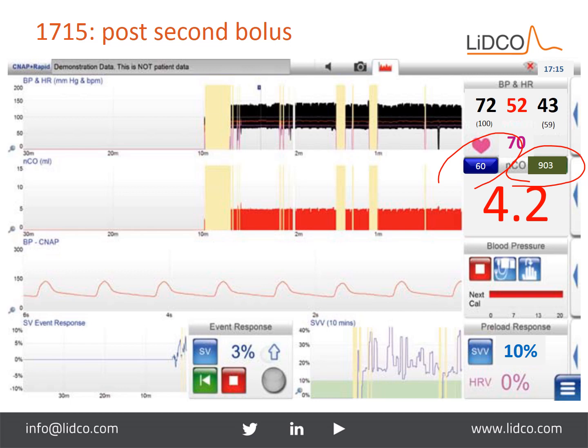Do we want to give him more fluid? How do we know if he's going to respond to fluid? Should we start a vasopressor? And how do we know? Well, we have another tool now. We have stroke volume variation, also known as pulse pressure variation. And this is measuring the circulation of the blood as it goes through the heart and the pulmonary tree, and the difference of the waveform that is being created by positive pressure ventilation. We often call this the ventilatory waveform.